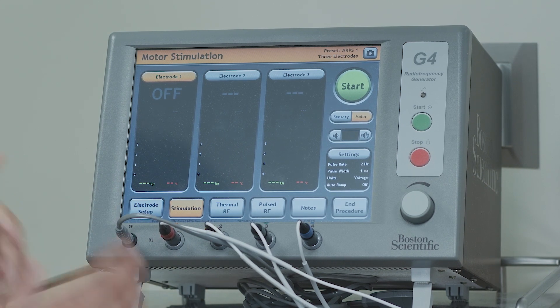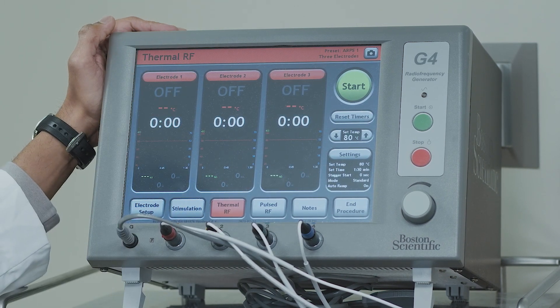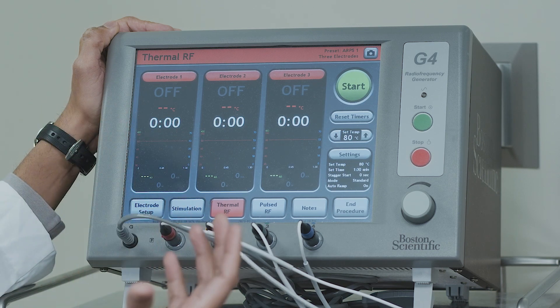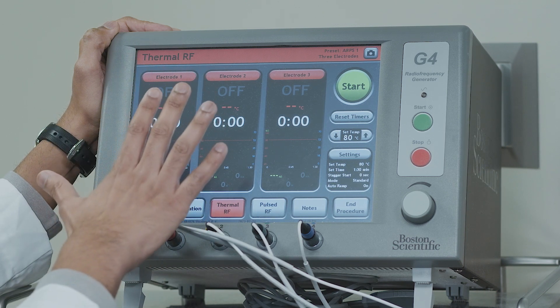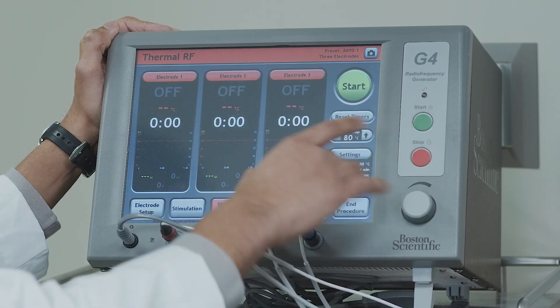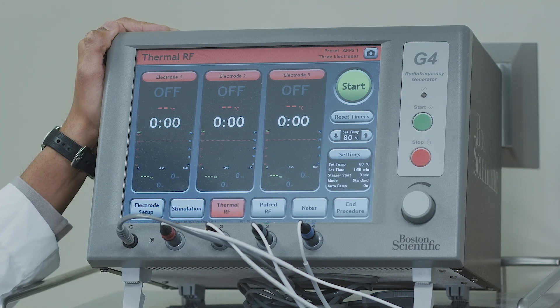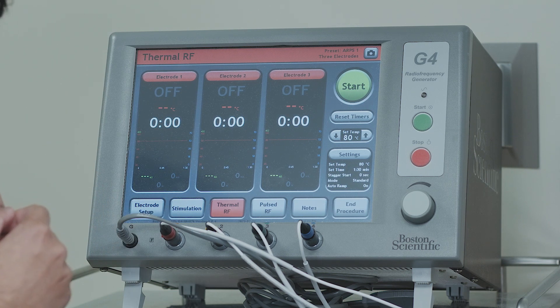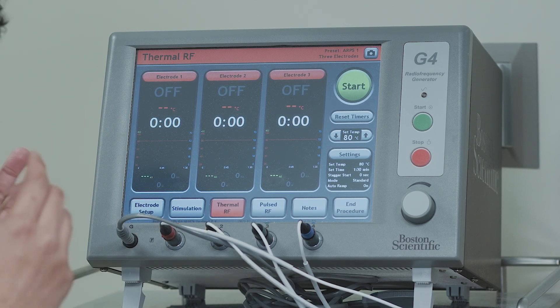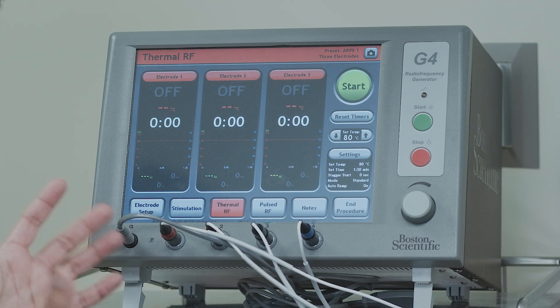Once sensory and motor testing looks perfect, we proceed to the RFA portion — thermal RFA. The interface of the screen turns red and our target temperature is 80 degrees Celsius. The patient has been given numbing medicine at this point so they're comfortable and sensation should be minimal. We hit the start button, a timer begins, and once the needle reaches 80°C the ablation runs for one minute and thirty seconds. After that first run, we flip the needles 90 degrees — it doesn't hurt and takes seconds. We flip them to give a circular burn in the area to ensure the procedure works, then run a second ablation for another one minute and thirty seconds. The RFA is then finished.